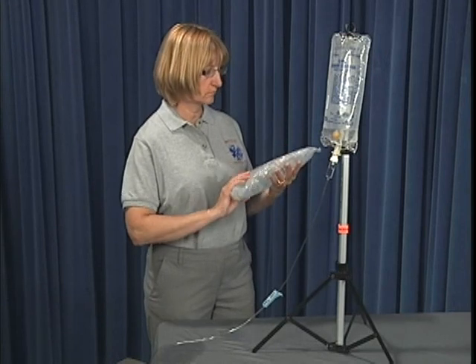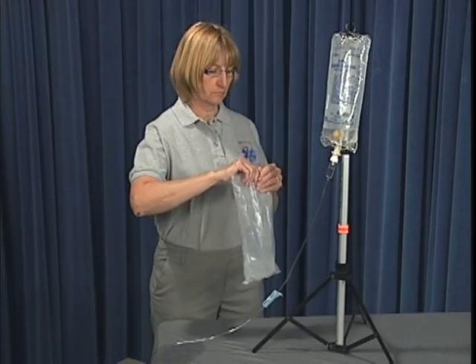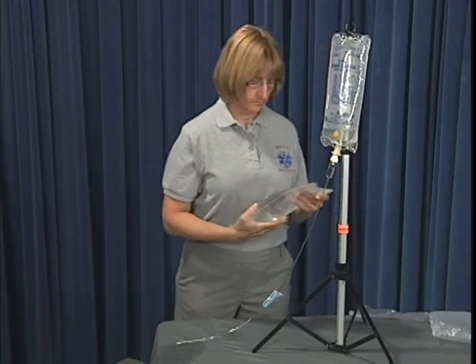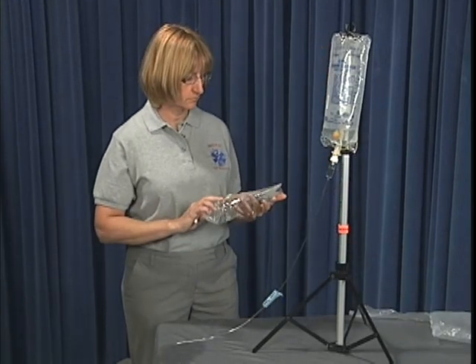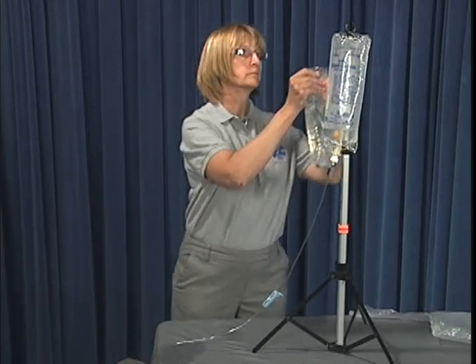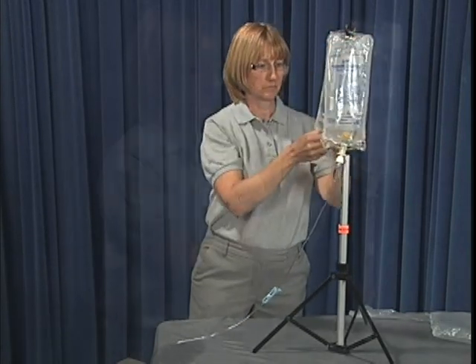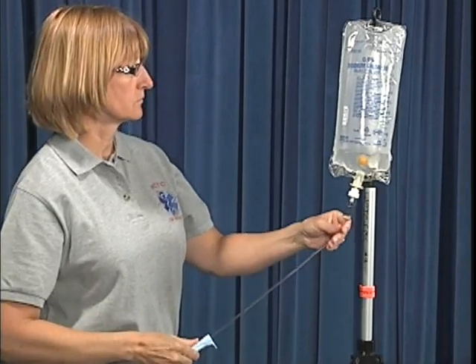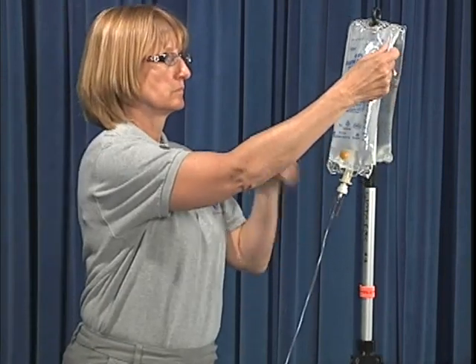To change an IV bag, select and inspect the new IV solution. Open the outer packaging by tearing the pre-cut slit at either end of the bag, and check for clarity and the expiration date. Shut off the flow clamp on the nearly empty IV bag to prevent air from entering the IV tubing as the solution bag is being changed.